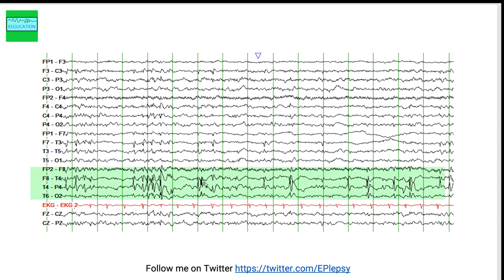This EEG shows changes in a patient with rolandic epilepsy with centrotemporal spikes. You can see temporal spikes in the right temporal region, and some in the left temporal head region as well. If you look carefully, you may also see activity in the frontocentral head region. This is a classic finding in benign rolandic epilepsy of childhood.